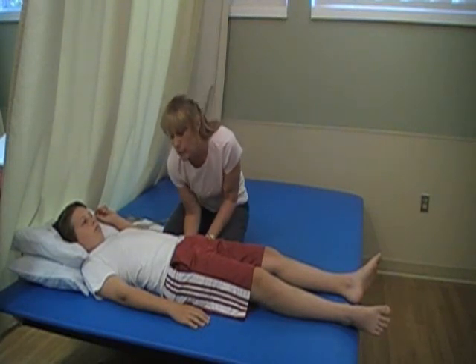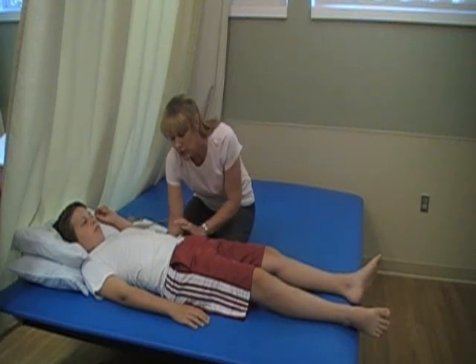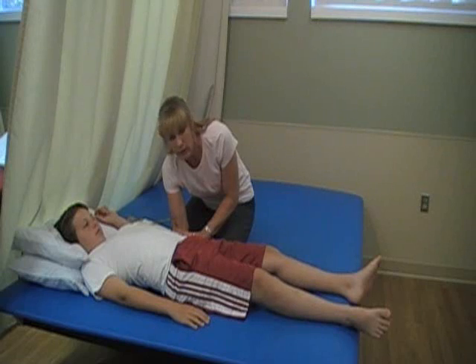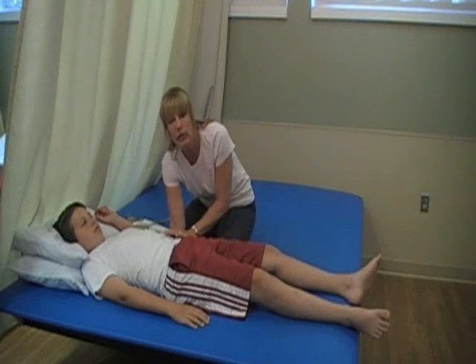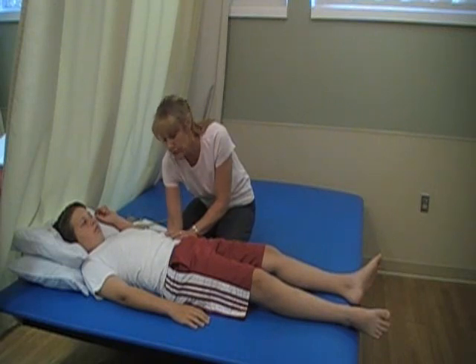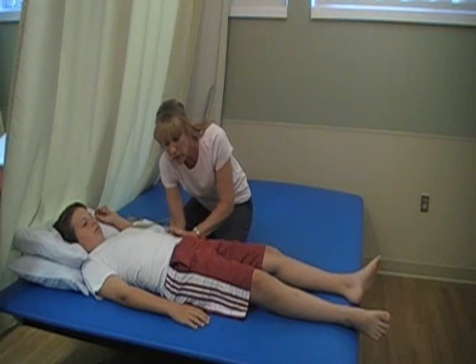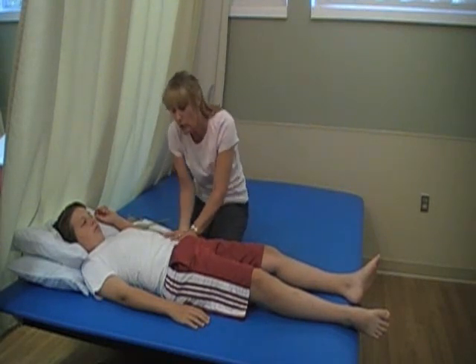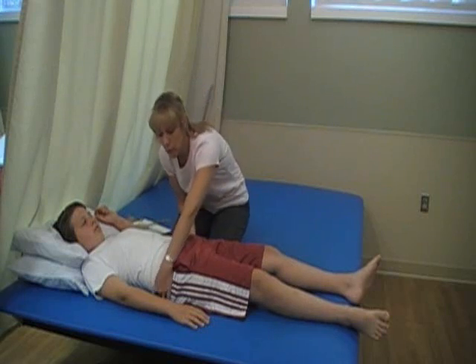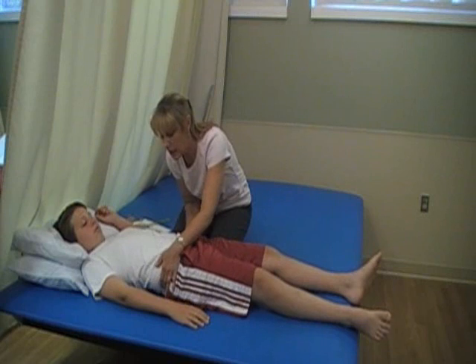You're going to take your hand and place it under the lower part of the spine. Then you're going to gently try to anteriorly tilt the pelvis. You want to make sure that you're noting if they have any flexibility or movement in that position. If they don't and they're fixed, are they fixed into anterior tilt or posterior tilt? You also want to look at the pelvis for the flexibility into rotation and lateral flexion.